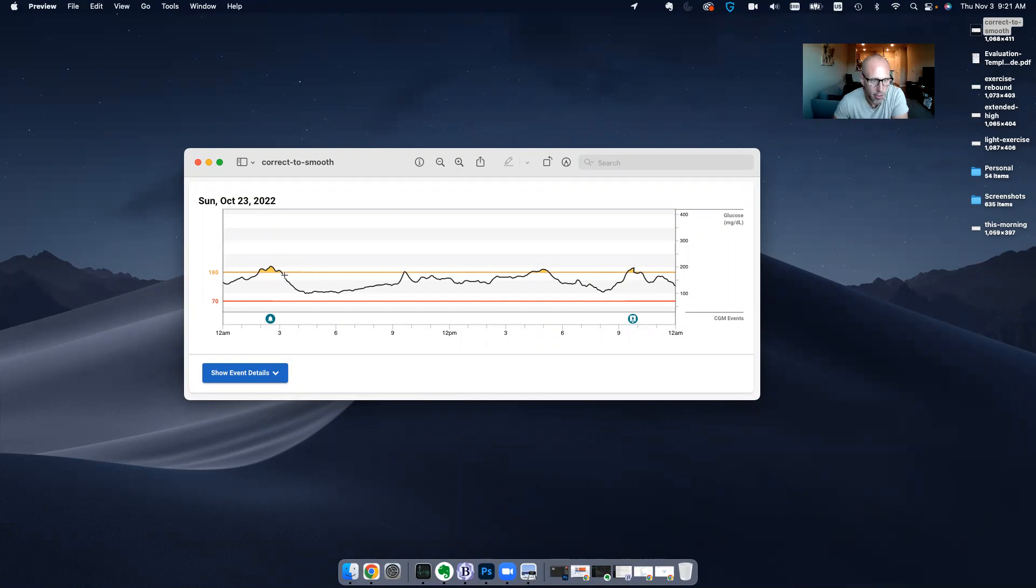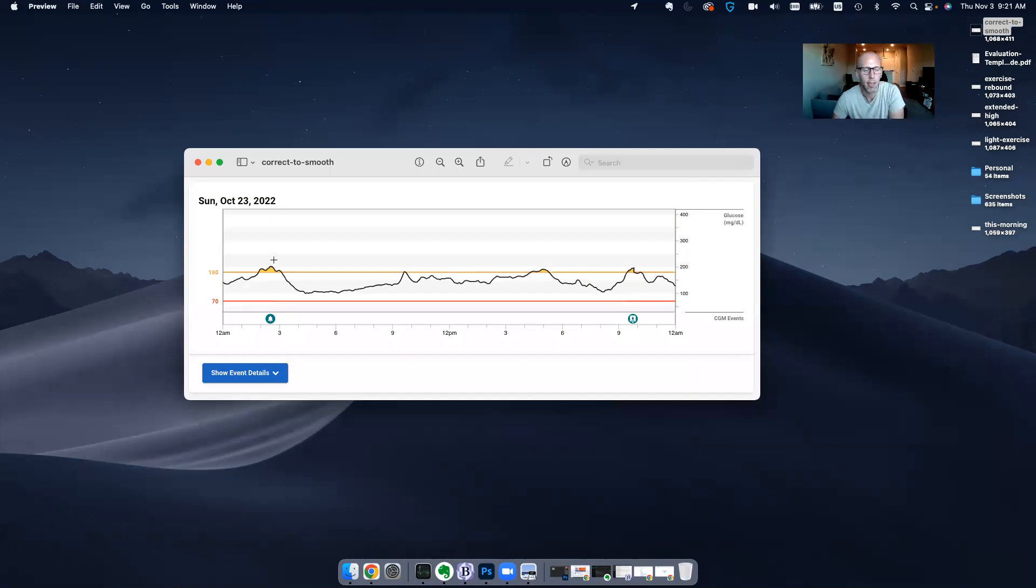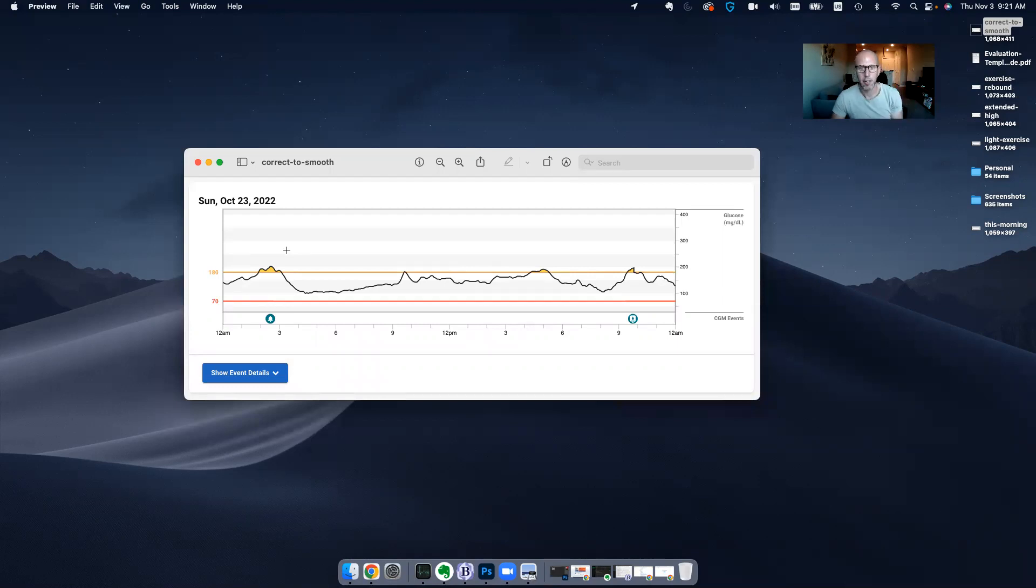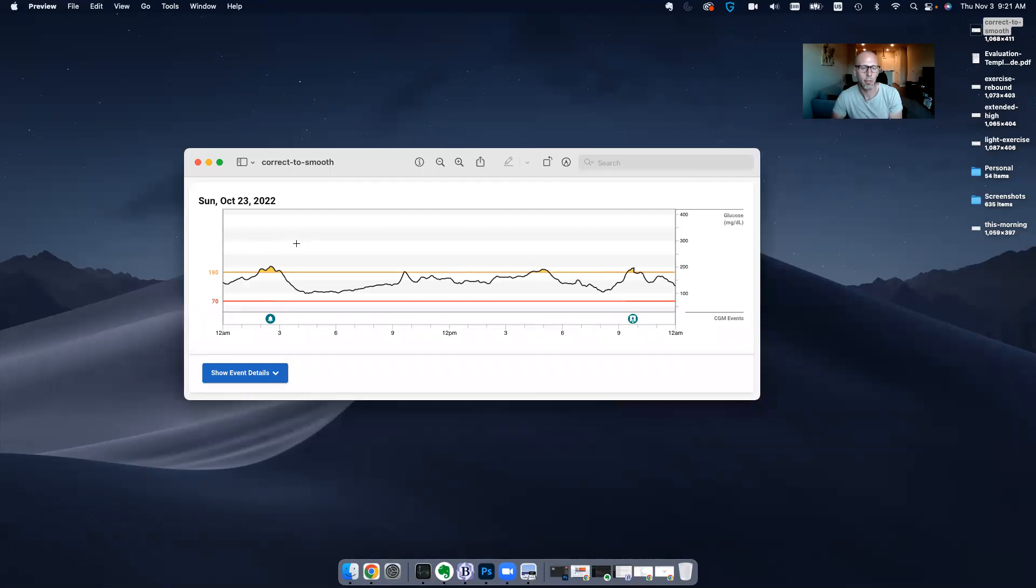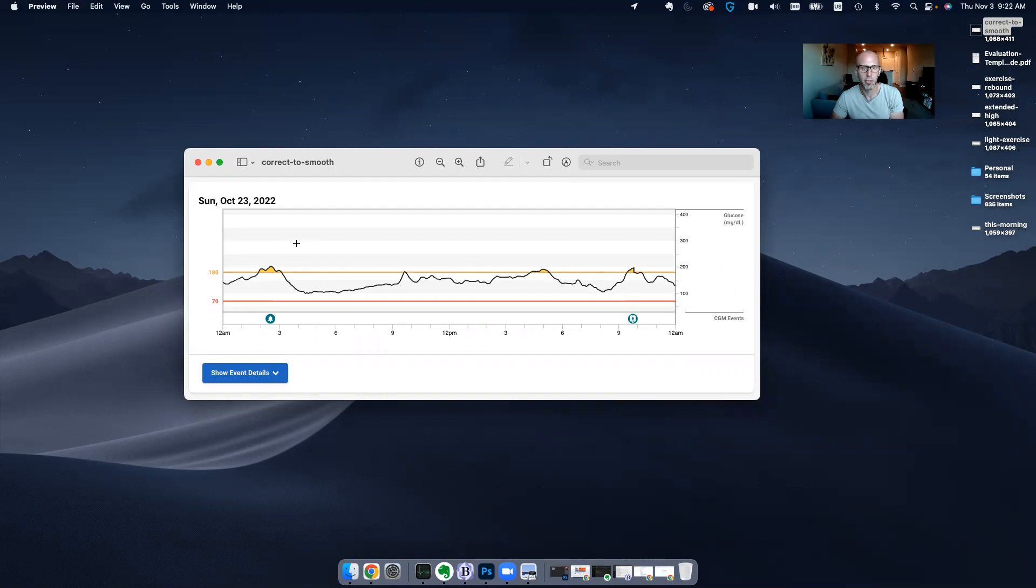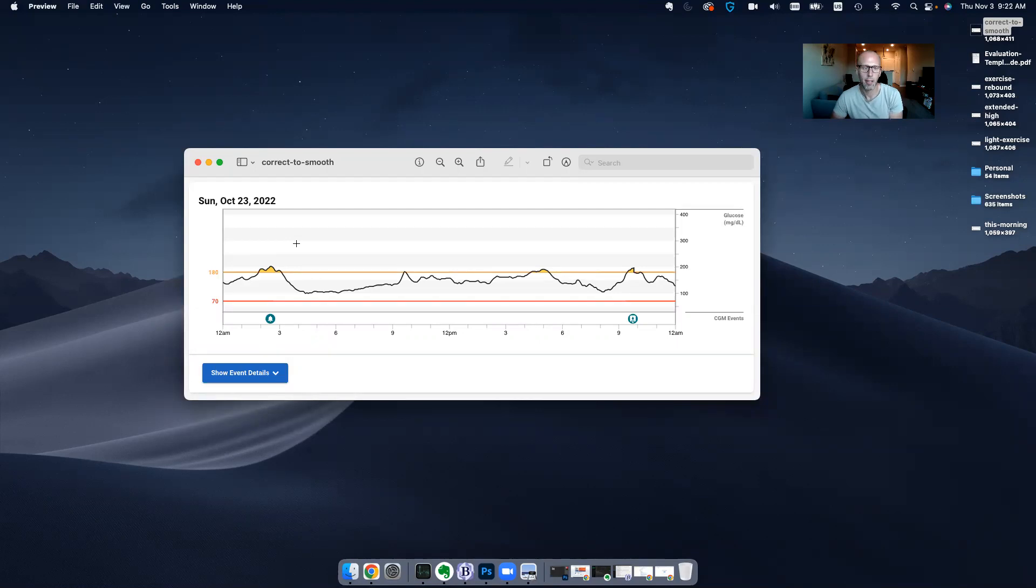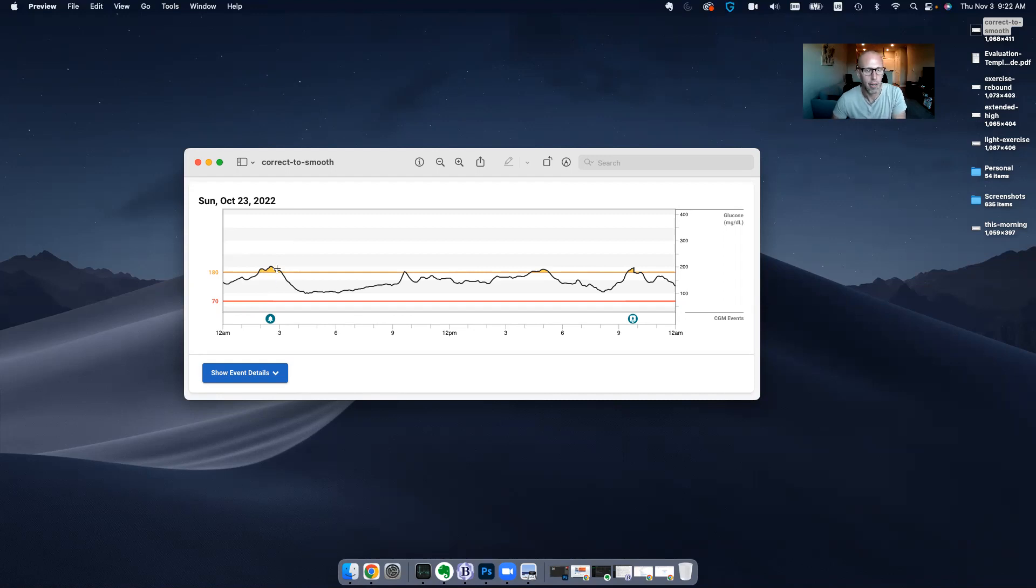So I used the smart bolus calculator to actually give me a correction. To take a step back, the system will know based on your insulin to carb ratios and your correction factors how much insulin you would need to correct a high blood sugar more quickly, but it's not going to do that automatically. So you have to actually go onto the PDM, press the actual bolus calculator, have it read your CGM, and then it's going to give you an estimated correction dose. And if you want to take that, you can, but that's not going to happen automatically. So this is an example of I opened up the PDM, I looked at the correction that was needed, I took it, and you can see I came down much quicker.